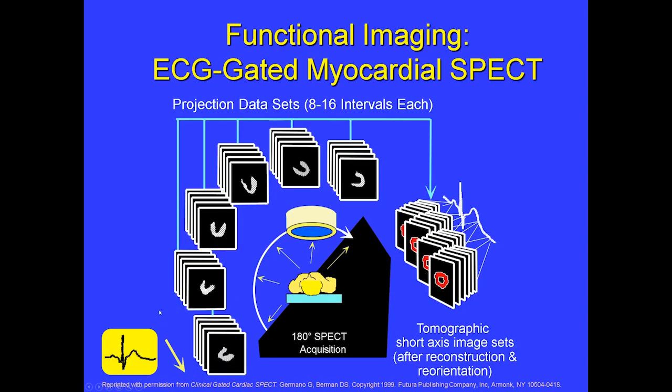When the images themselves are acquired for SPECT imaging, particularly for nuclear cardiology, they can be acquired in a static mode around the patient, specifically for rest studies. That is often done. But they can also be acquired in gated mode, where the EKG helps determine the gating.